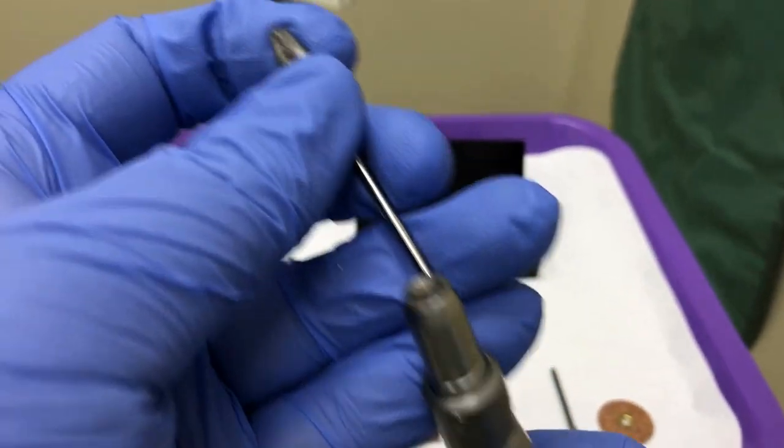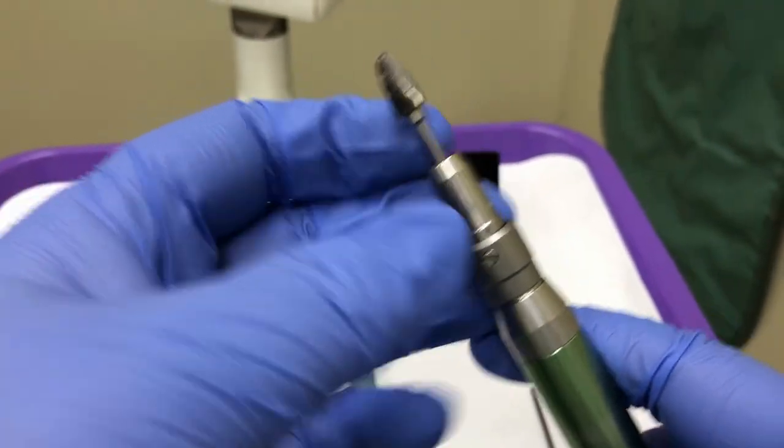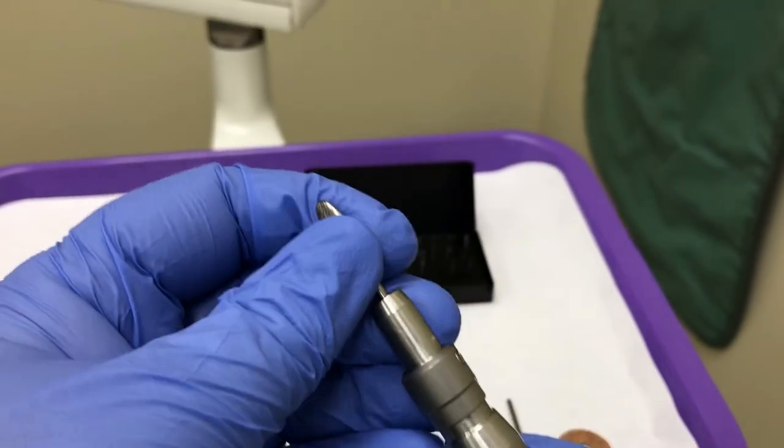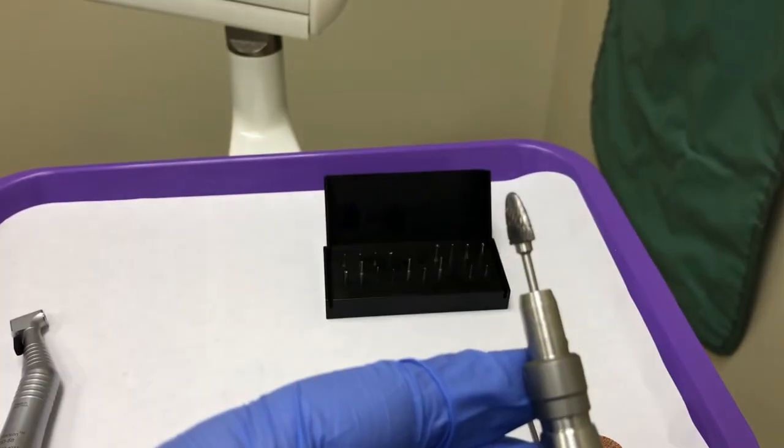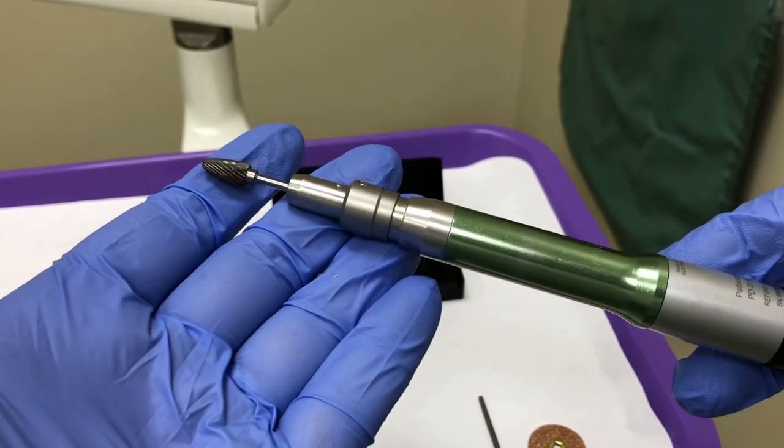To attach a laboratory burr, make sure the straight attachment is unlocked, and insert the burr into the opening. Once the burr is inserted, twist the collar to lock it and verify the burr is secure.